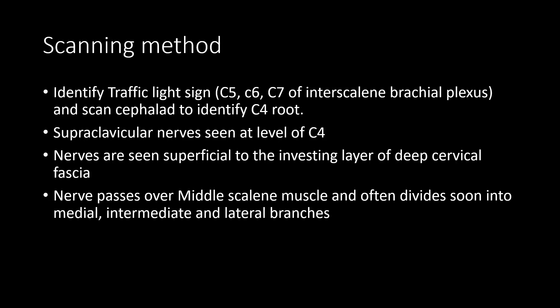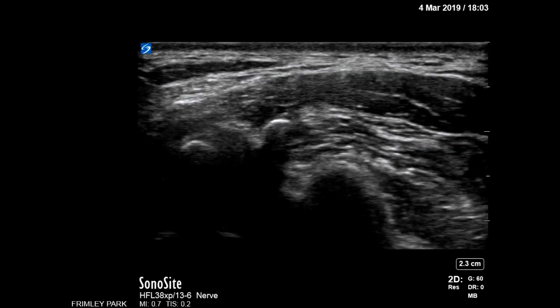Immediately after emerging from the posterior border of the sternomastoid, the nerves divide into the medial, intermediate, and lateral branches over the middle scalene muscle. In this transverse scan at the level of C4, you can identify the sternomastoid and its posterior border, the C4 root, the transverse process, and the middle scalene muscle. The supraclavicular nerves are seen just above the investing layer of the deep cervical fascia.